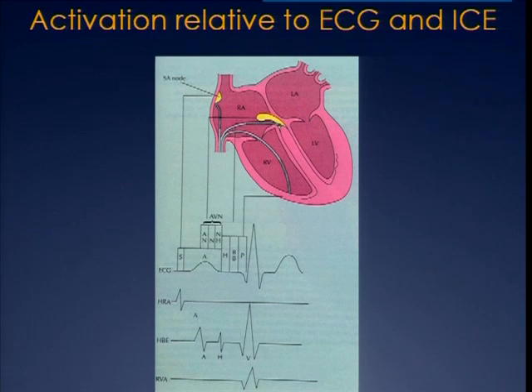Now, before we go any further, there are a couple of things that I'd really like you to understand. Before you look at an ECG, and this goes out to all the postgraduates as well as the GPs, it's extremely important that as soon as you take an ECG, you label it with the patient's name, the time and the date. In fact, mix-ups in the ICUs are extremely common, and during training we had an incredible situation where a patient with a dissection of the aorta was lying right next to another man who had come with an anterior wall MI.